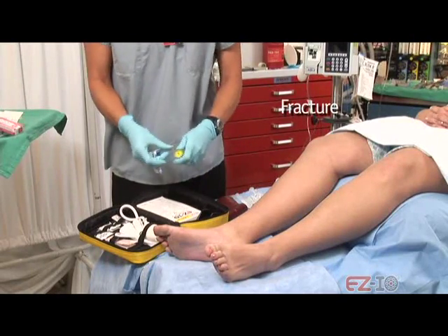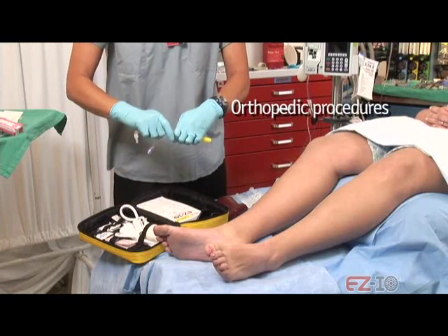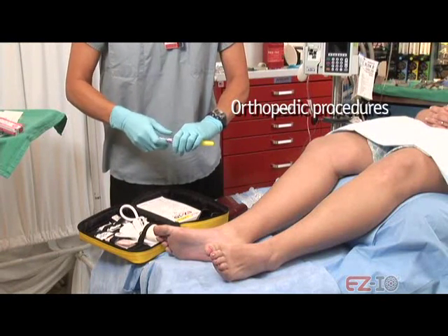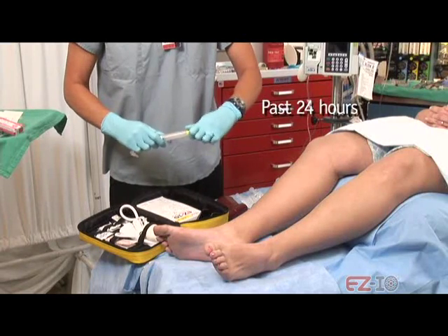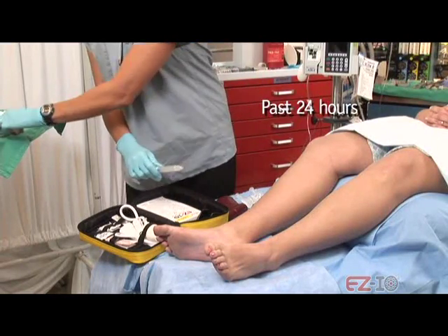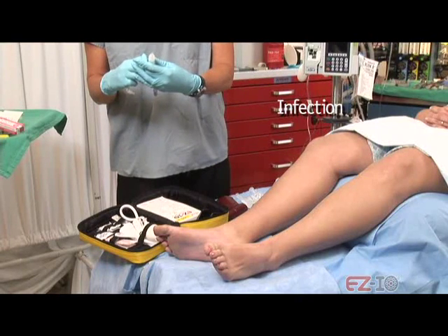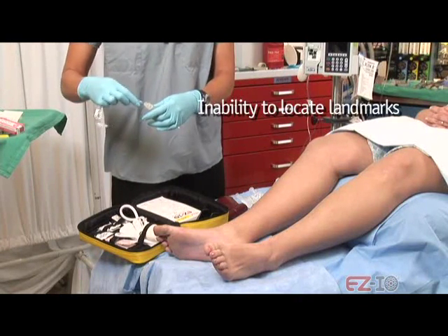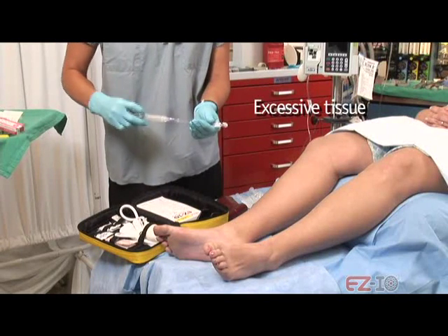The following are contraindications for easy I.O. access: a fracture on the targeted bone, previous orthopedic procedures near the insertion site, a prosthetic limb or joint, I.O. has been used within the past 24 hours on the targeted bone, infection at the insertion site, or an inability to locate landmarks or excessive tissue.